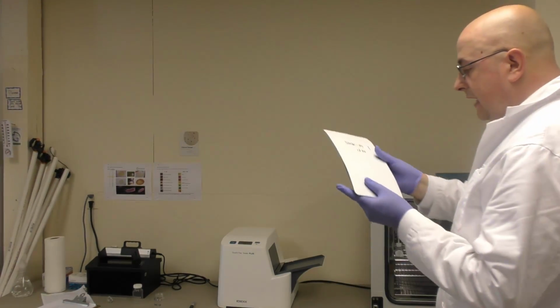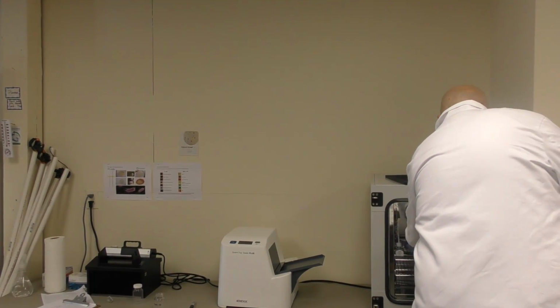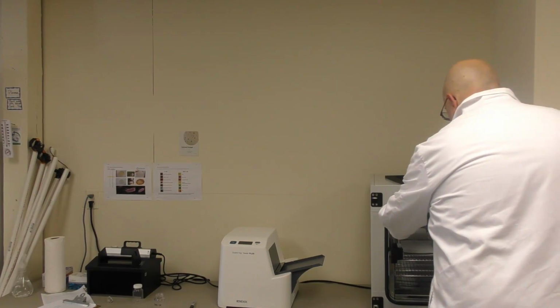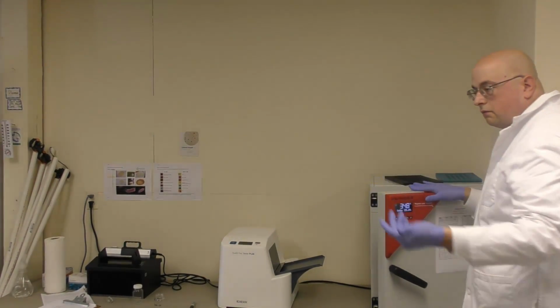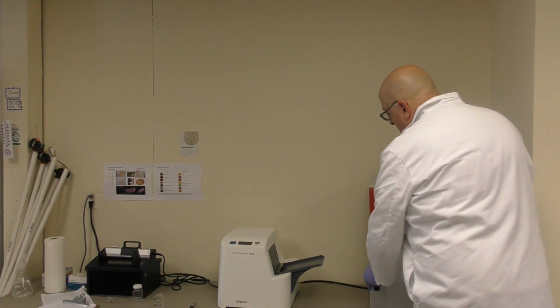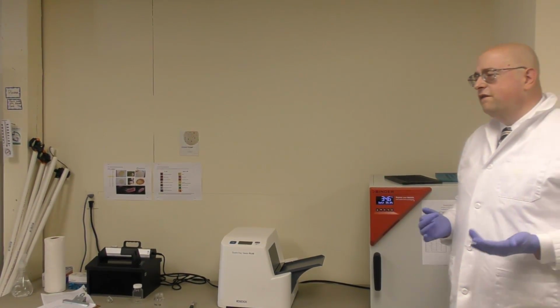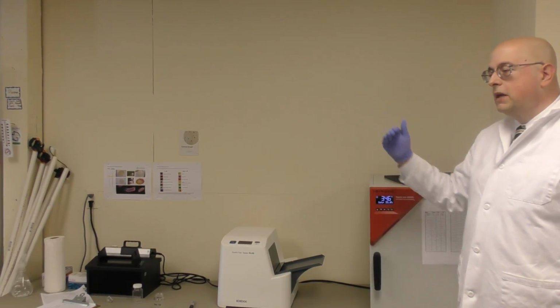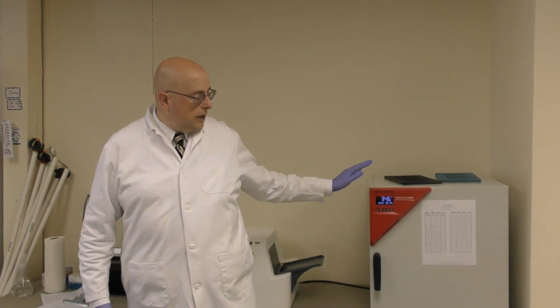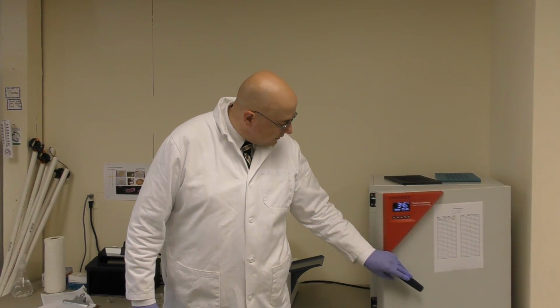So now you take your samples and load them in your incubator, and you'd place them upside down, so the plastic is facing down. It doesn't quite matter if it is facing up, but we found that facing down, at least you have all your information on the back, so you're not grabbing the wrong samples when you're retrieving them. And the trays set up here in the incubator are at the right locations.